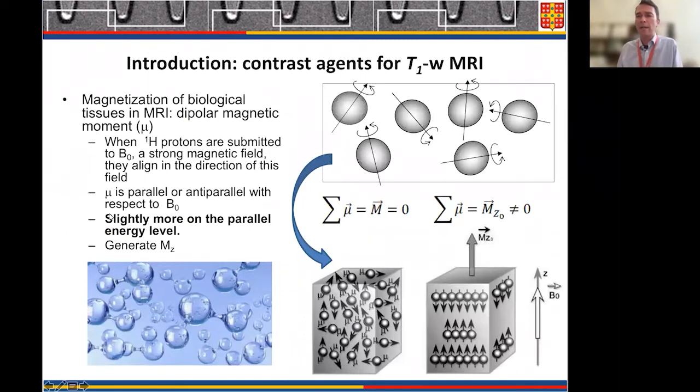So what is MRI and how is the signal generated? MRI is based on the excitation of water protons, mainly the hydrogen protons in the water contained in the human body, which can be stimulated. You insert the patient into the MRI scanner, and the magnetic field strength in the scanner is typically 50,000 times higher than the magnetic field of the planet.